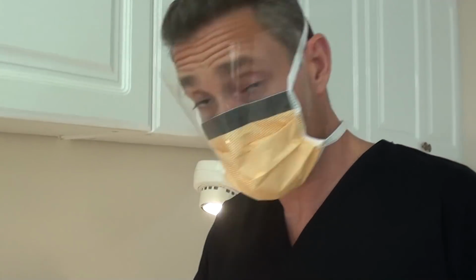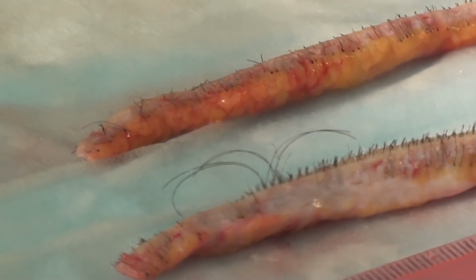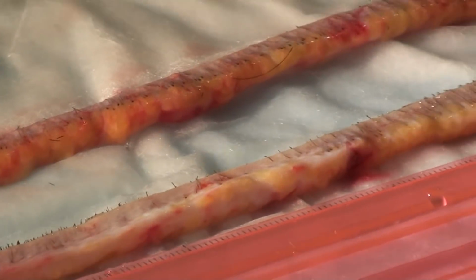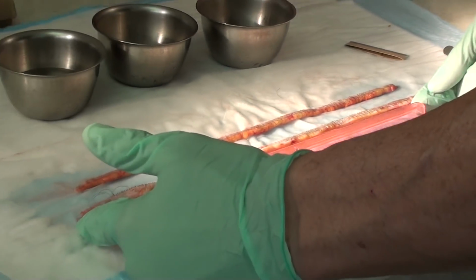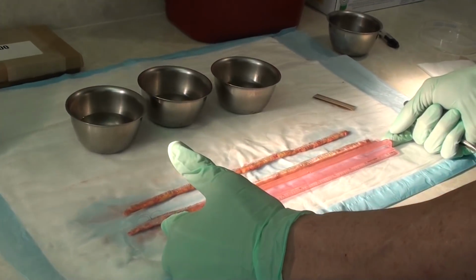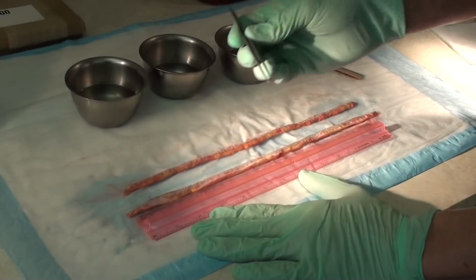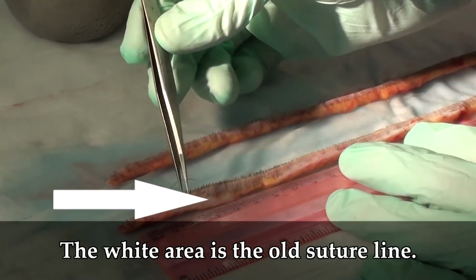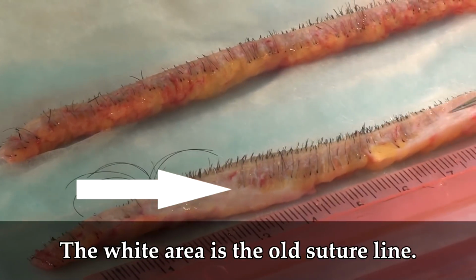Okay, so we just got through harvesting the donor, and what we did is we excised the entire old donor suture line out. We were able to pull out 33 square centimeters of tissue. As you can see here, this is a ruler, which is 12 inches, which is also approximately 30 centimeters. So there's 30 centimeters, then we have an additional about 3 centimeters on each thing. So each one's approximately 33 centimeters. Now when you take a look here, you'll see this little white area. The little white area is where we dissected out the suture line, the previous one. So that's just some initial scar tissue.